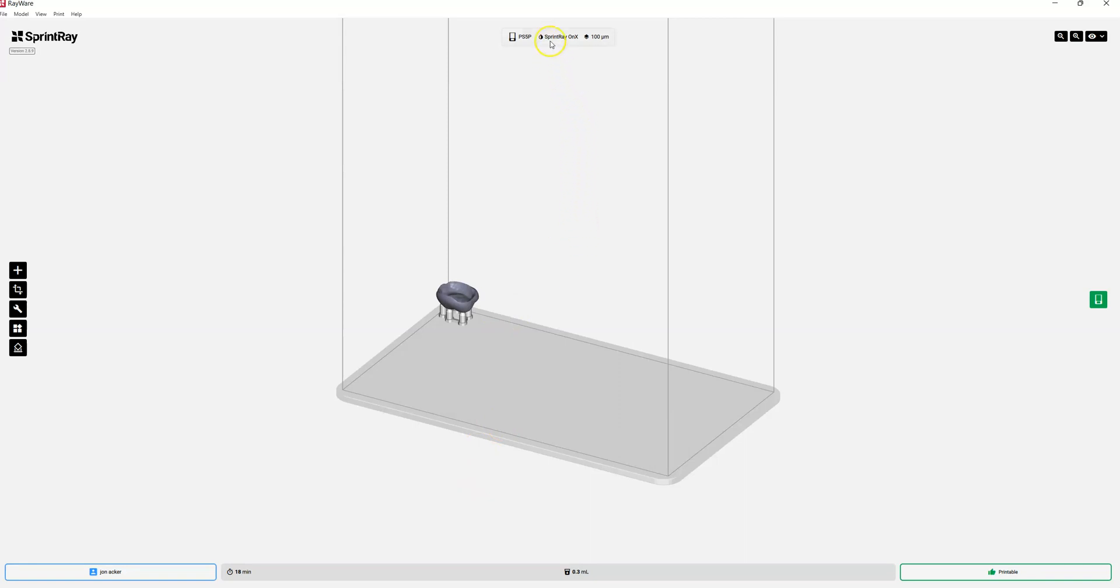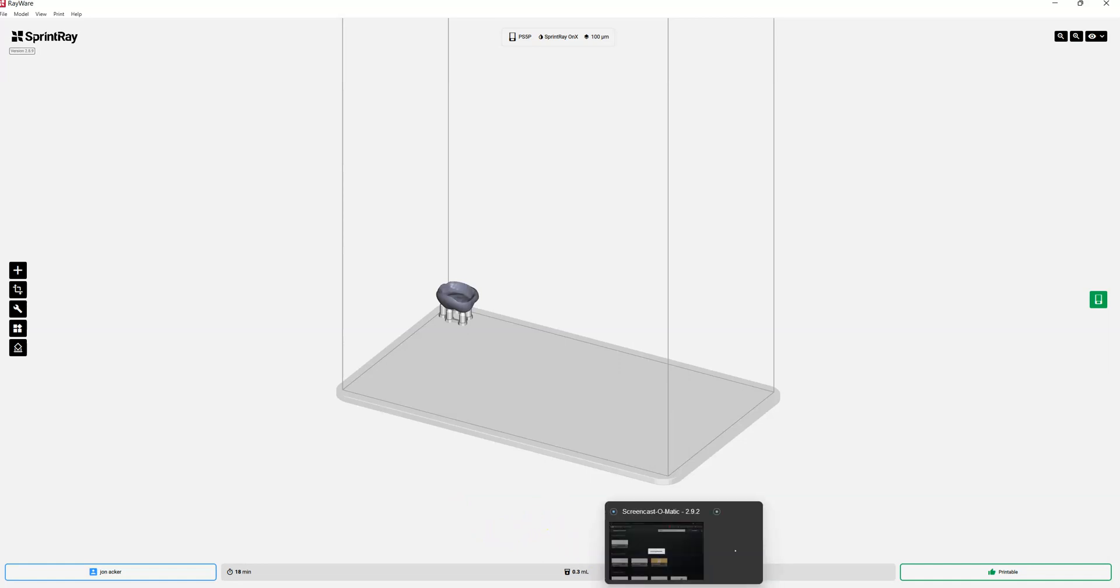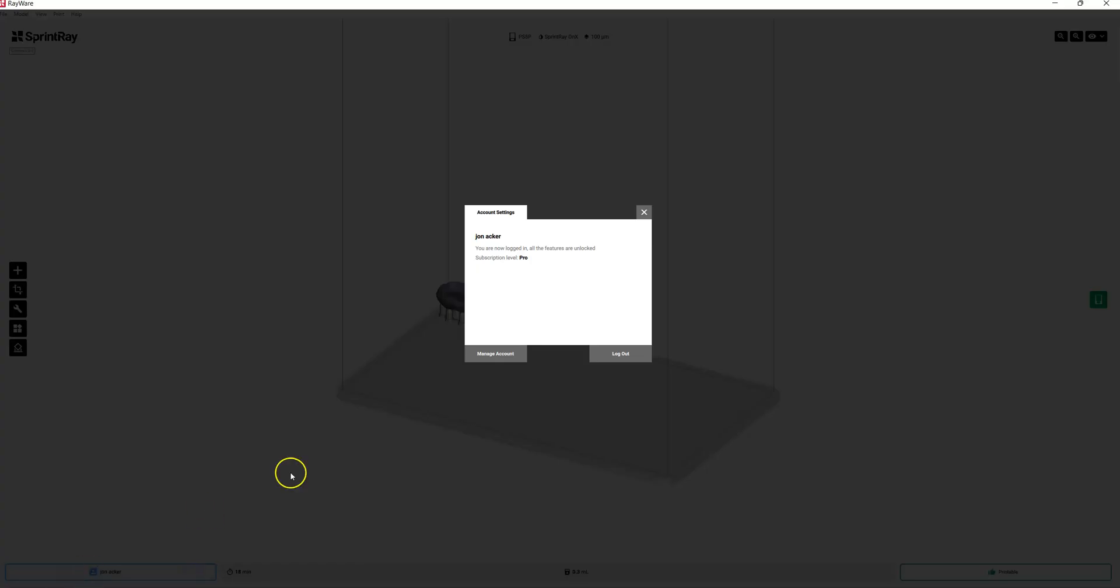You can see I already have Sprint Ray Onyx selected in my Pro 55 S printer and this crown can print in about 18 minutes. It couldn't be easier to go from scan to design into either print or mill using the clinic's web-based CAD software. I appreciate you watching today and we look forward to speaking with you soon.